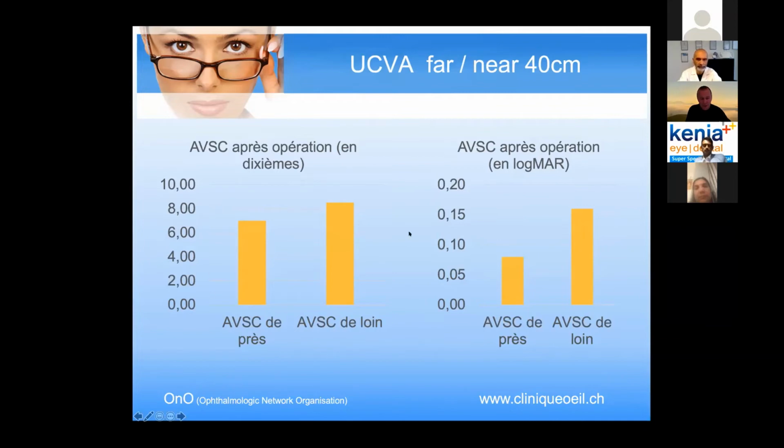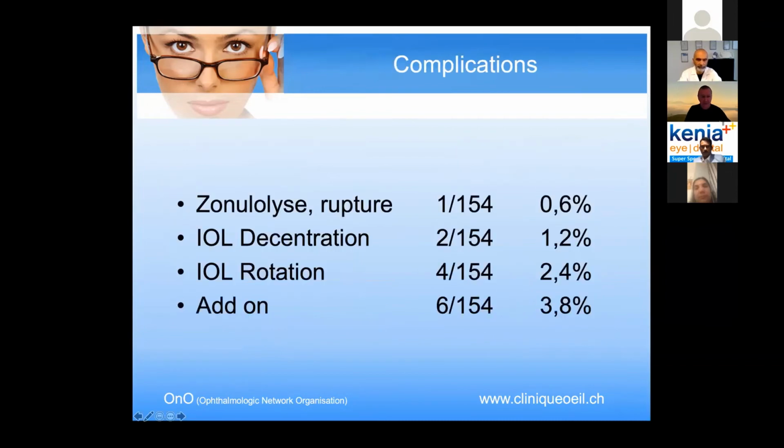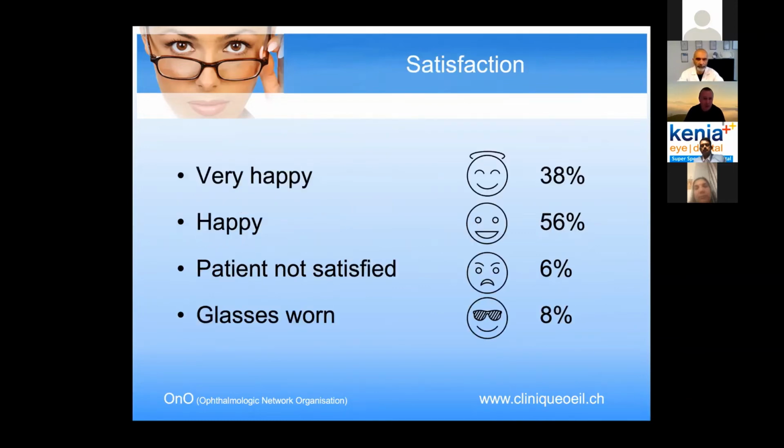So it's quite very good results, and the people are quite happy with these lenses. We have, for complication, it's not a complication with the lens, it's a rupture, a decentration, and rotation of the lens. Sometimes we are surprised when you do a toric Lucidis, you have sometimes a rotation. And we introduce the add-on, which saved our life. Really, it's a good system to correct the lens. I will show you later.